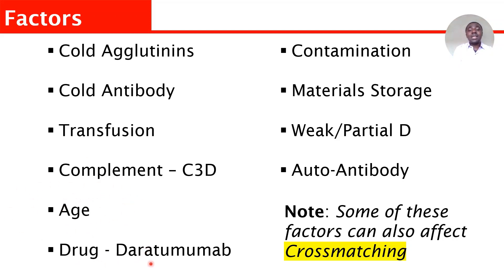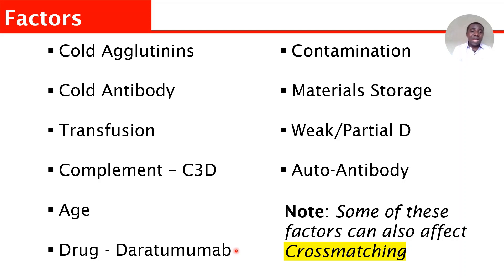Another factor is the drug daratumumab. This drug can affect blood group and antibody screening. Once somebody is on this medication, it can cause reactions throughout. It will require a special technique to get the blood group and antibody screening. Scientifically, this drug binds with CD38, which is lowly expressed on red blood cells, and it can mask antibodies — that's why you can find it difficult to detect the blood group or antibody screening. This is why a patient can get pan-agglutination or pan-reactive results across all wells.